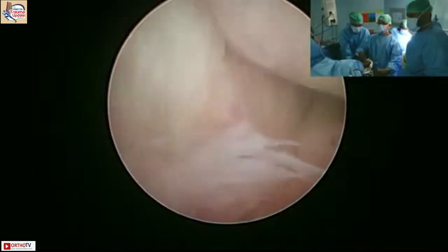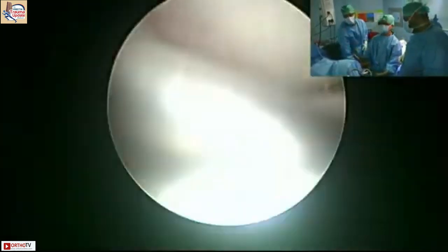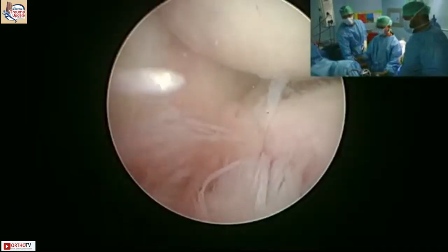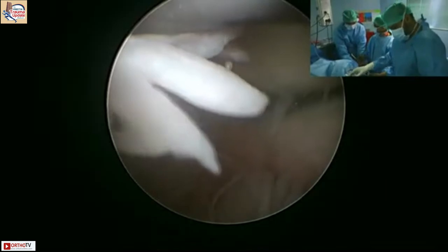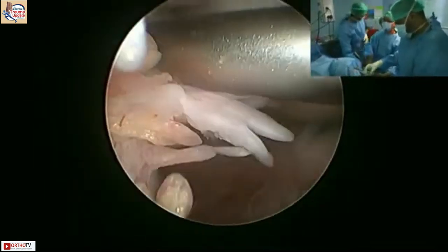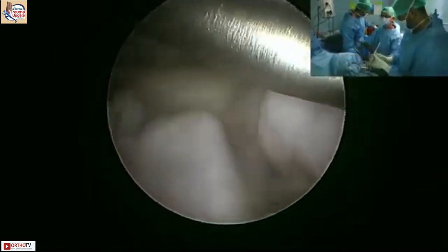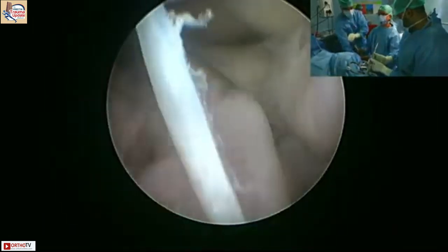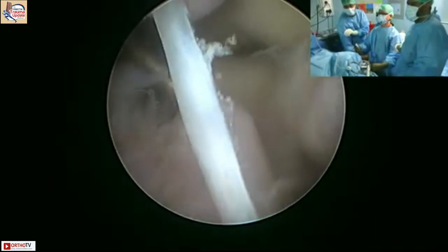So I've come a little anterior, where have I come? There. That's okay, I'll work with that. So the more anterior you are, the better it is, because your working is easy. The more closer to the arm you are in the portal, so now I need a smaller shaver because I've got a 7, or you give me a bigger trocar. Gautam, I think we have a 4mm shaver. Yeah, you have a 4mm shaver, because I've got a 2.9 scope. We had a 2.4 shaver, but yesterday it got stuck, I think. So I had some technical issues. That is the loose body.